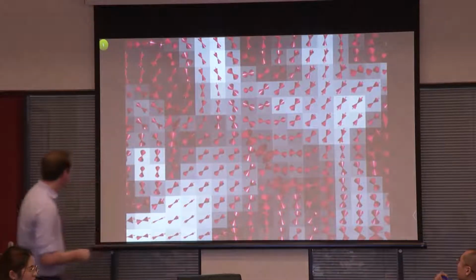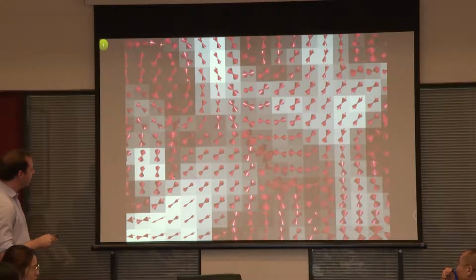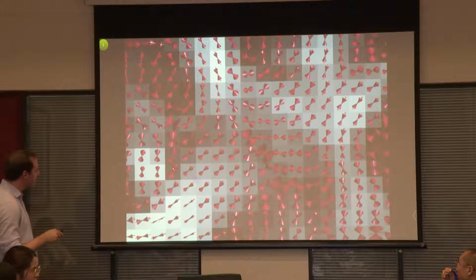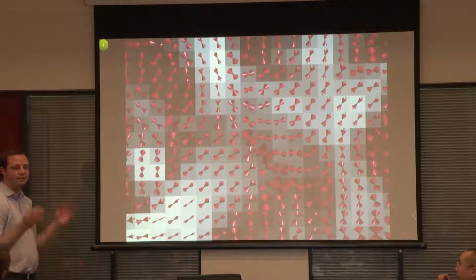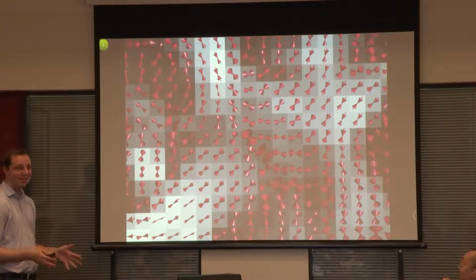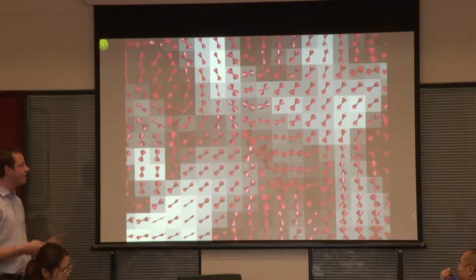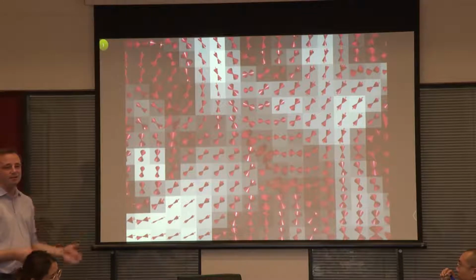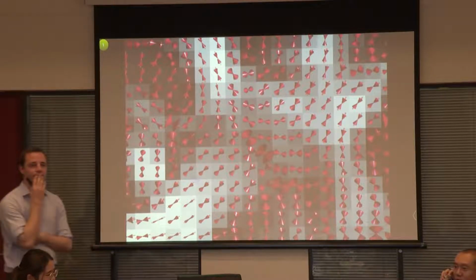Yeah, this one. So this is probabilistic tractography. So let's say, take this one. You have good information that the tracks go like this, but you also add some Gaussian function to it, so you are allowed sometimes to go like this, or like this. So probabilistic tractography is really adding noise to the data, I think. Nobody describes it that way, and they all have fancy terms, but it's basically not always taking the best, but sometimes taking a detour.